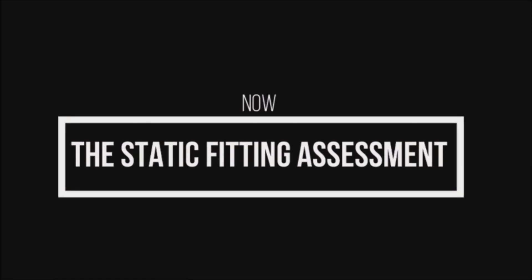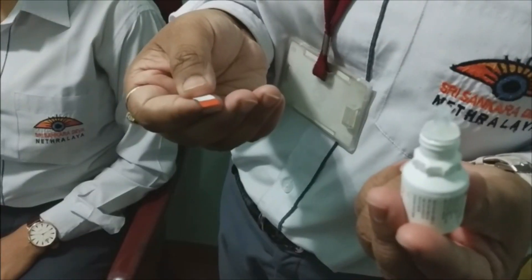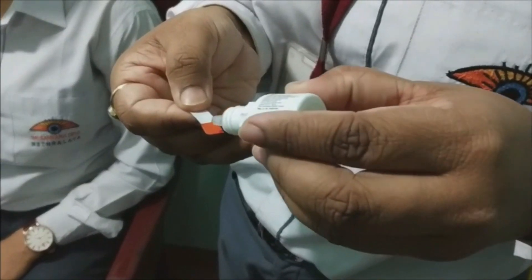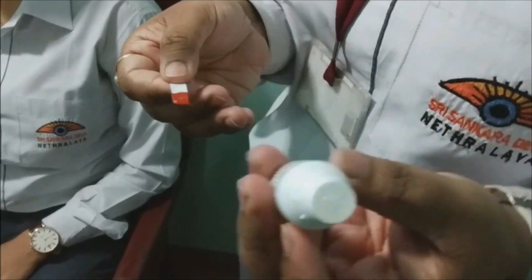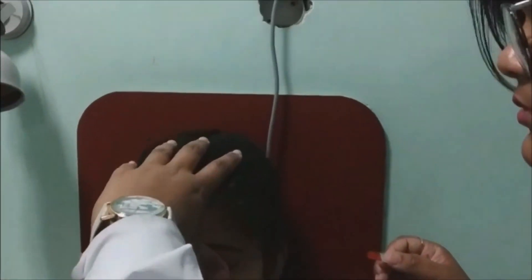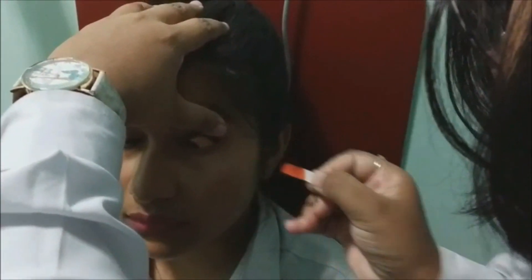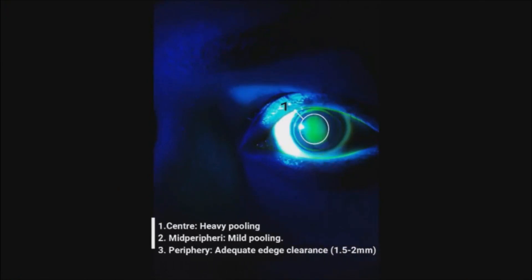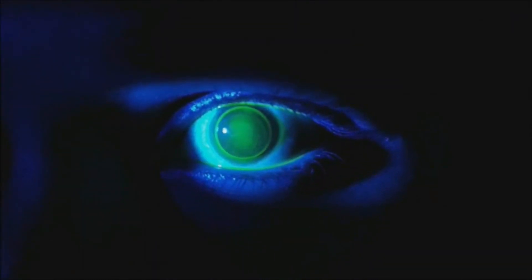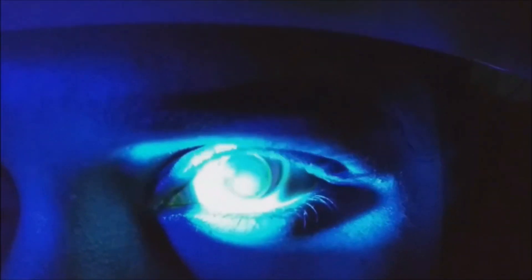Next moving on to the static fitting. We lift the upper right lid with the thumb of the left hand, and with the right hand holding the fluorescein strip, we stain the upper palpebral conjunctiva to assess the static fit. In static fit we check the center, mid periphery, and the periphery of the lens. In our case the lens center has heavy pooling, in mid periphery there is mild pooling, and the periphery has inadequate edge clearance of 1.5–2 mm.